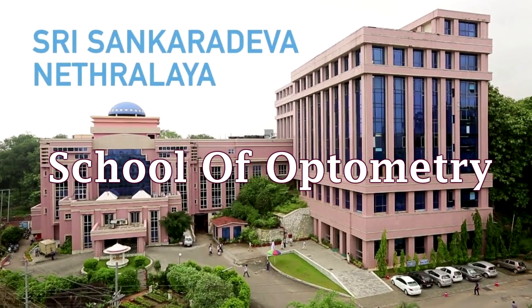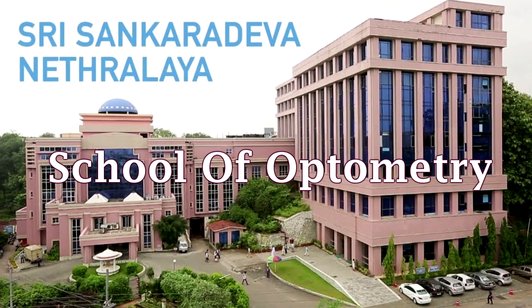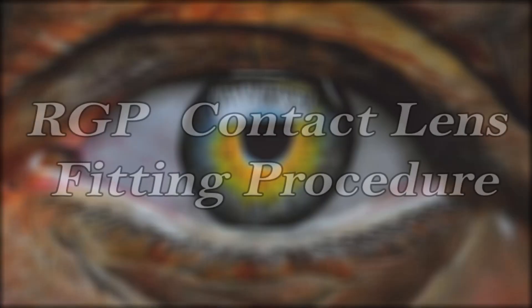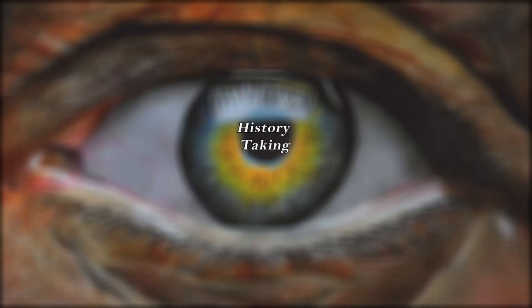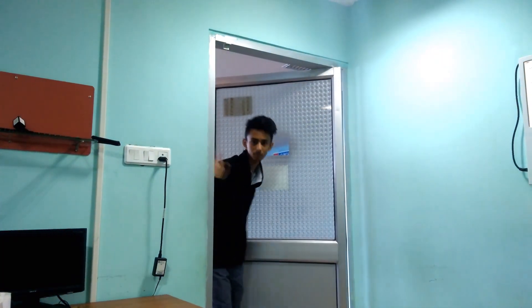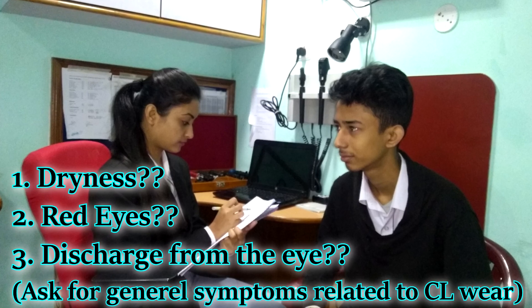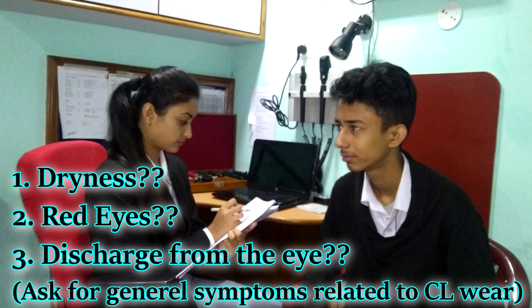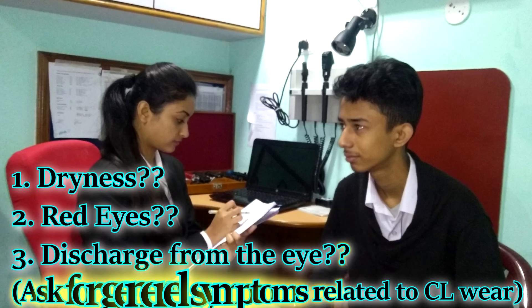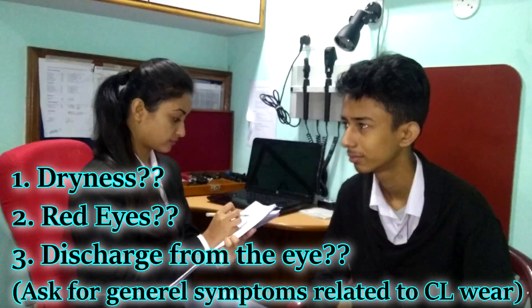Hello everyone, we are the students of Sri Sankar Devan at Chalaya, and in this video we are going to demonstrate every step involved in rigid gas permeable contact lens fitting. First we have to go for history taking. When a patient comes for RGP lens, we have to take the ocular and medical history. This is the most important step as it will let us know if the patient is eligible for RGP lens or not.